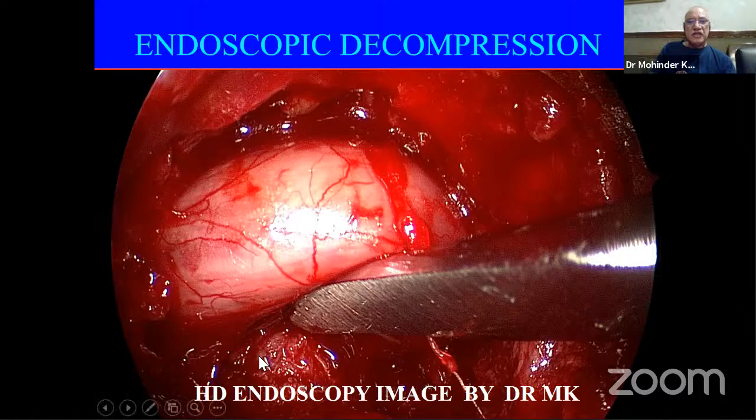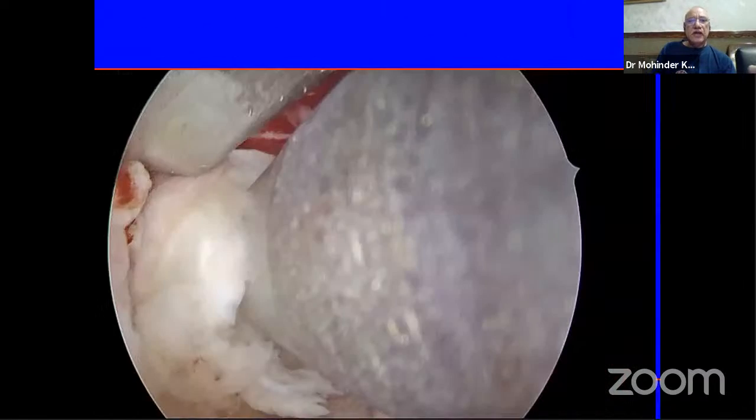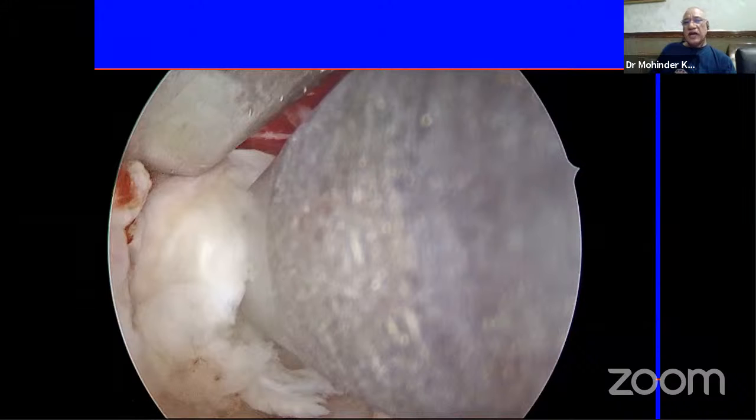Second, you can see how I have nicely exposed the disc here. And the next step is to prepare a disc bed and put in the graft. And now I have changed over to saline mode. Now in my view, I feel the advantage of UB is that through a single port, I am able to achieve disc surgery, neural decompression, discectomy, and canal decompression.